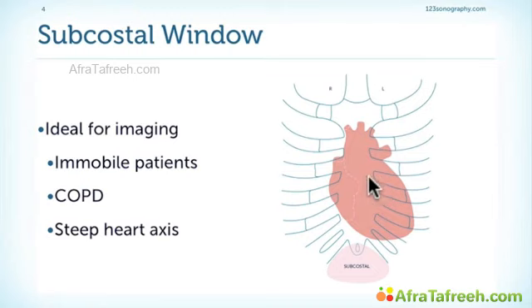It's ideal for imaging immobile patients who can only lie on their back, for patients who have COPD and where the lung obscures the apical window, and for patients who have a very steep heart axis where the heart is located right here behind the sternum.